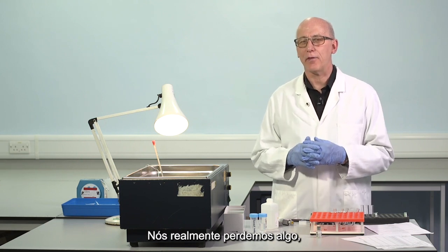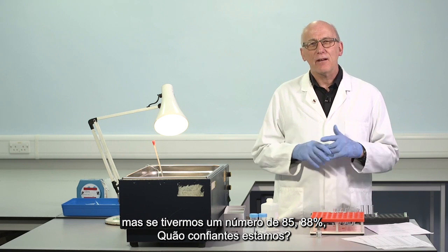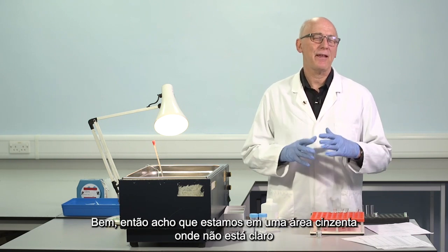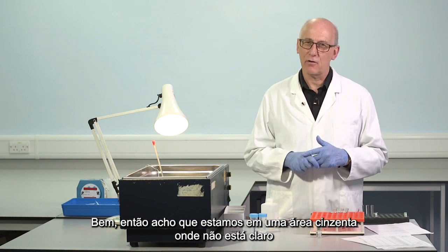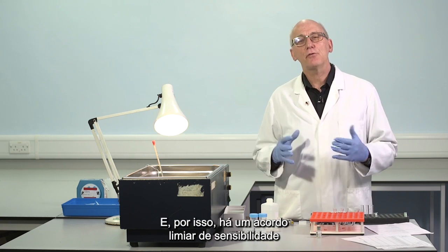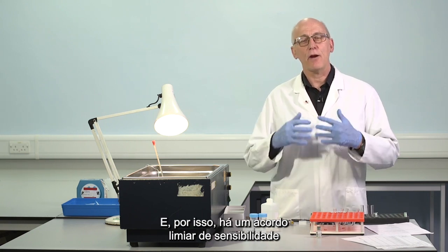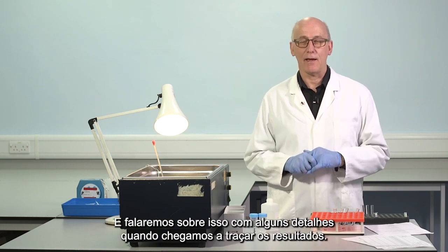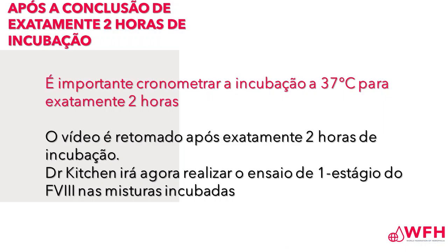We really have lost something. But if we get a figure of 85, 88%, how confident are we? Well, then I think we're in a grey area where it's not clear, because we know the assay is subject to variability. And for this reason, there is an agreed threshold of sensitivity. And we'll talk about that in some detail when we come to plot the results.